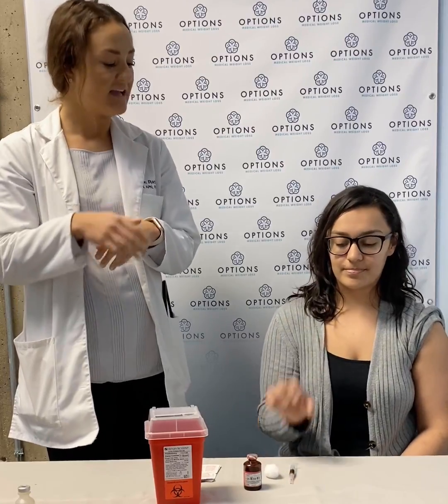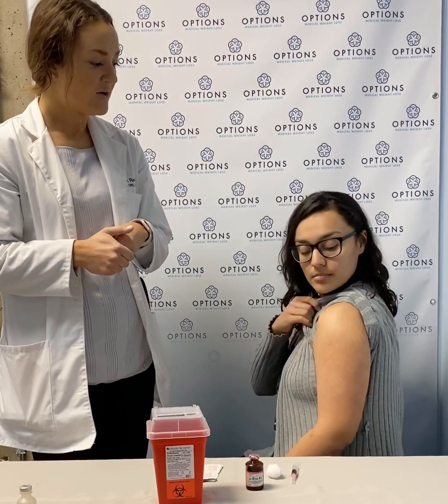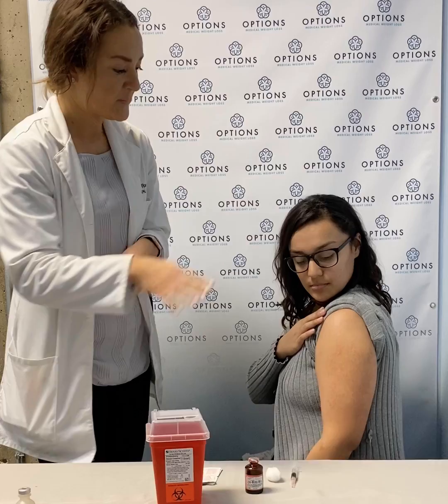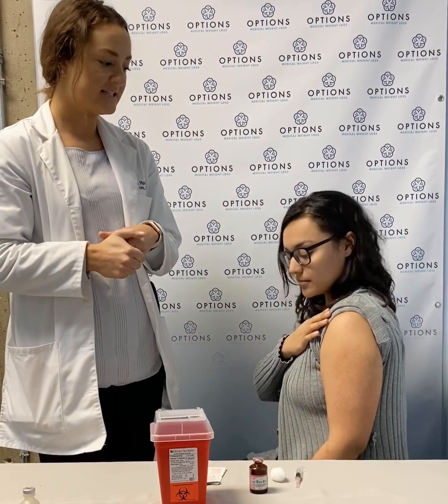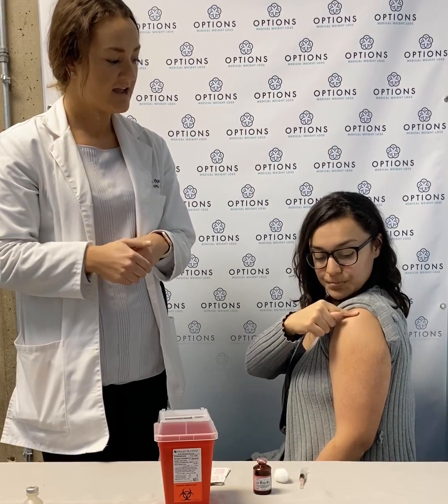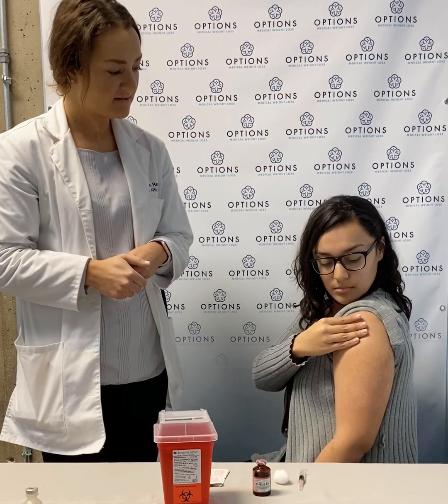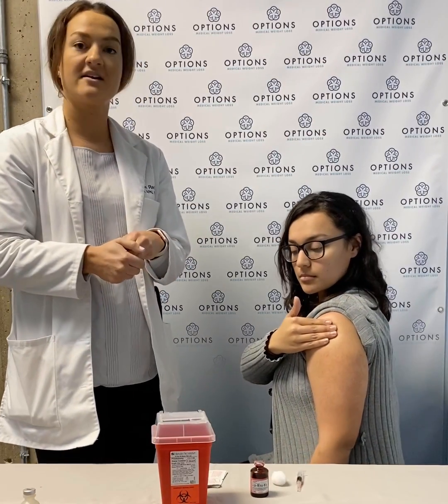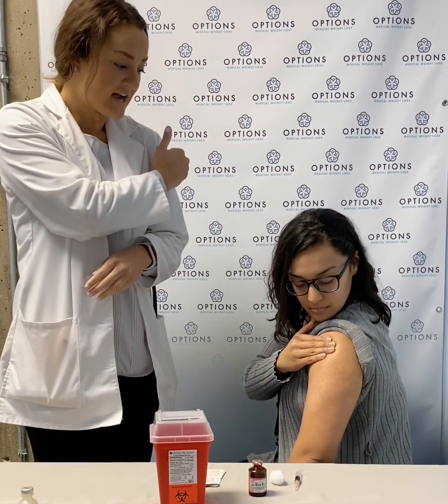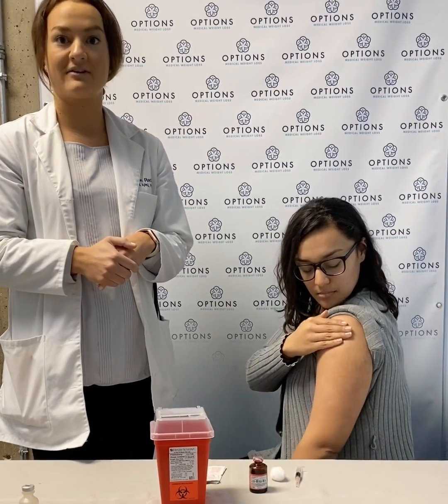First thing we need to do is find the point of reference on our deltoid muscle. We do have an image to show you to make it easy, but then we will go ahead and find our landmarks here. So Leslie, feel the top of your shoulder for a bony point. And then you are going to go four fingers down from that point. Now if you look at the skin there, if there is a freckle or a point of reference, that would be great. If not, go ahead and make just a little indent with your nail there so that you have a good point of reference.